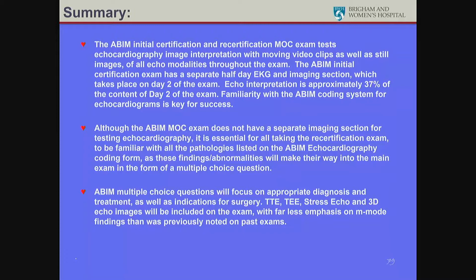ABIM multiple choice questions will focus on appropriate diagnosis and treatment, as well as indications for surgery. Transthoracic echo, TEE, stress echo, and 3D echo images will be included on the exam, with far less emphasis on M-mode findings than was previously noted on past exams.